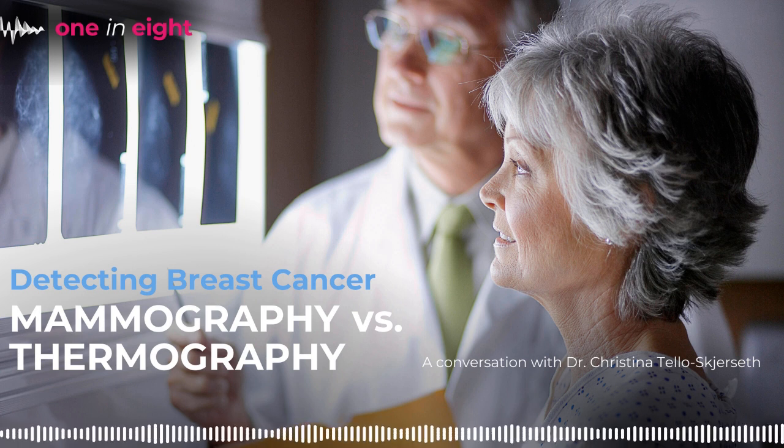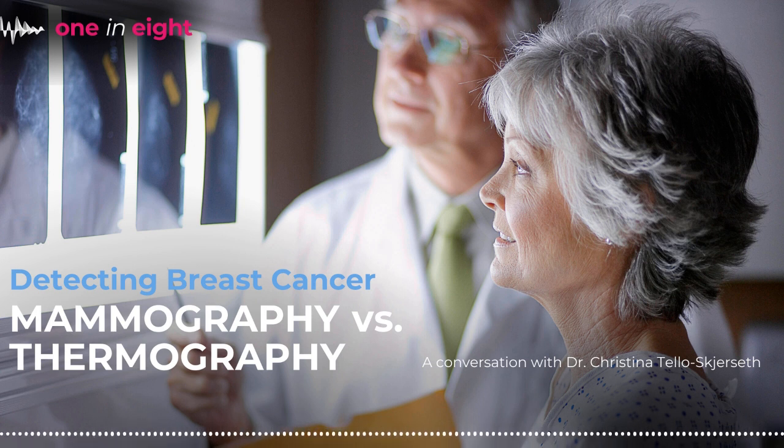What kind of misinformation are you hearing or reading about, specifically when it comes to thermography, as some might compare it to mammography? Can you help clear the air there? Let me start with the main benefit of mammography. It's the only screening tool we have that has shown from decades and decades and decades of research to decrease mortality from breast cancer, meaning your chance of dying from breast cancer. And studies have shown that there's a 40% reduction in breast cancer mortality using screening mammography.